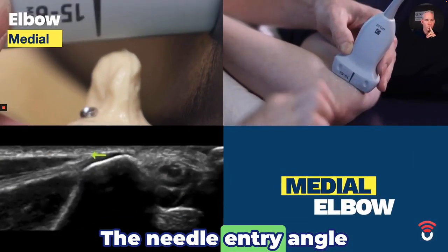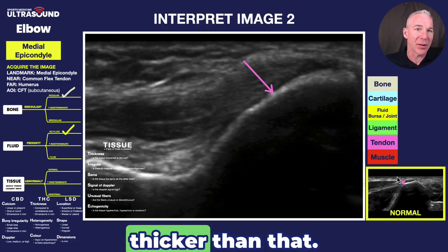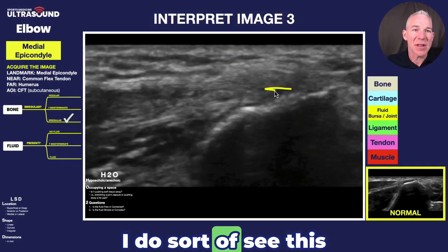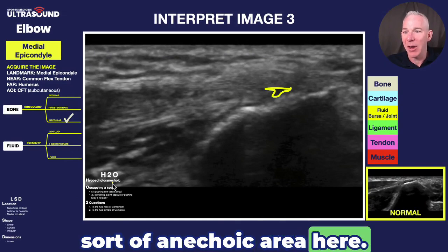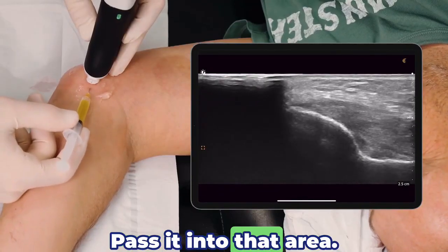The needle entry angle is — that's significantly thicker than that. I do sort of see this anechoic area here. Next thing you know, I've got a one-inch needle, pass it into that area.